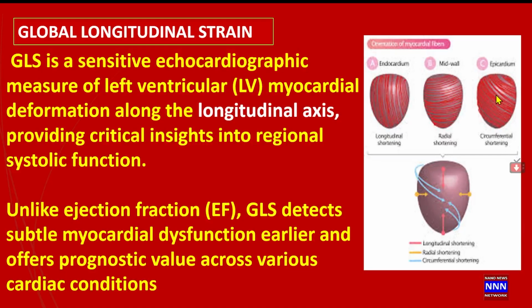And here, this squeezes, just like you squeeze a wet towel, the same way the ventricle squeezes. So let me give a demonstration of how the heart functions.